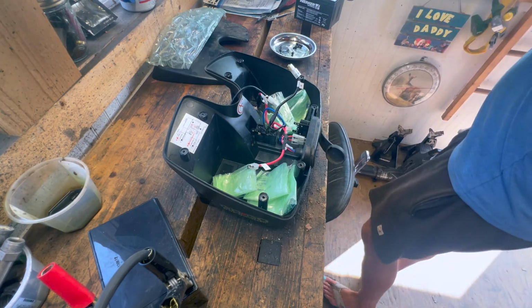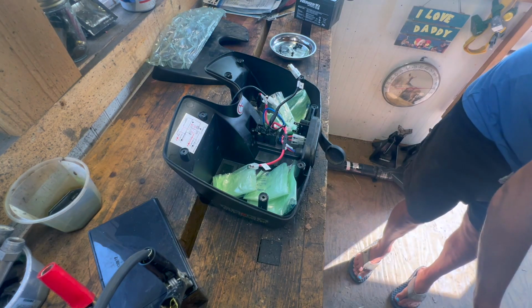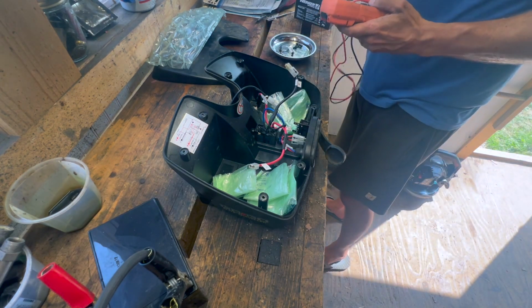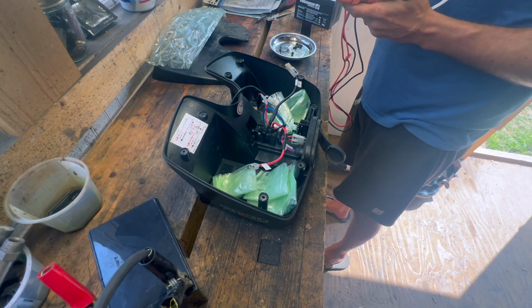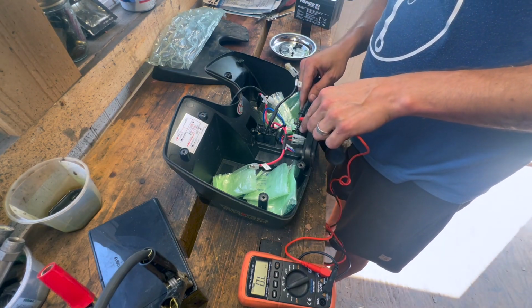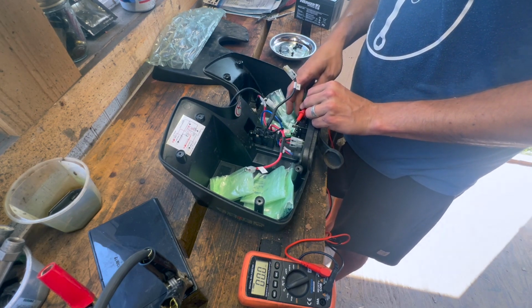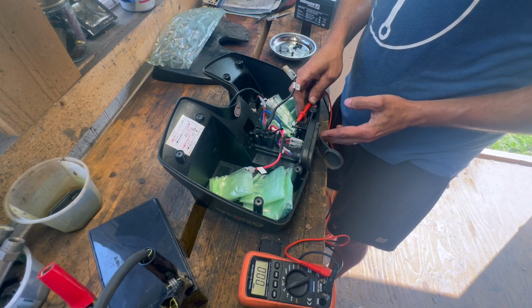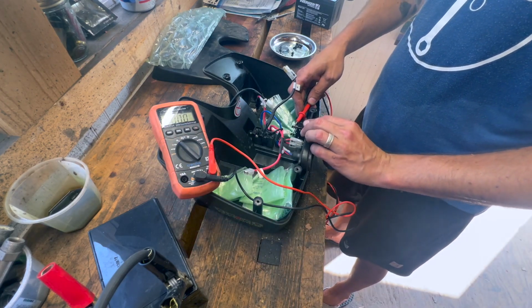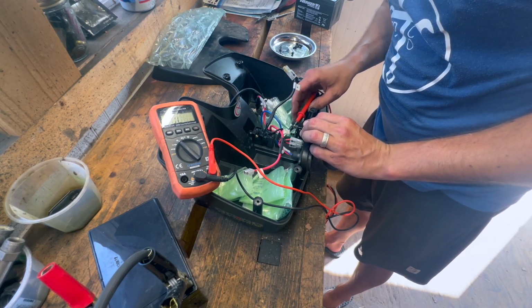So we can take a multimeter and switch for ohms. So right now we're open. It doesn't matter which side you connect to. It says we're closed, and when I hit the switch, I get nothing. So I think the switch is probably bad.